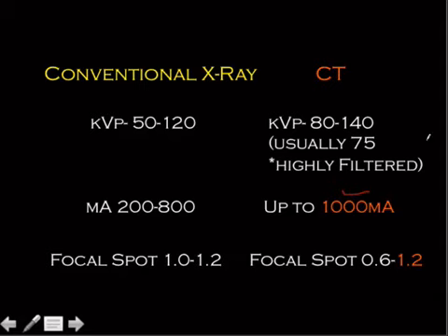The other thing is that the beam is very filtered. Remember that, especially when you're using contrast, you're trying to hit at a very specific K edge.